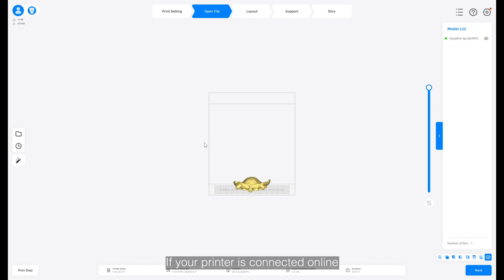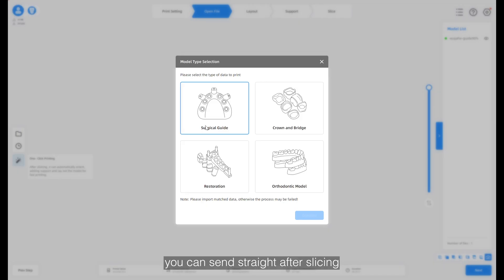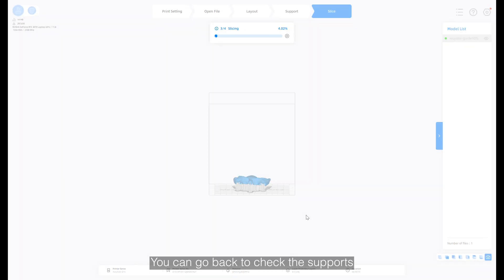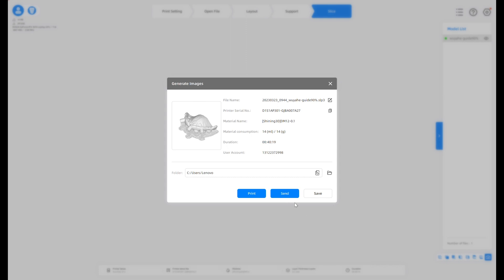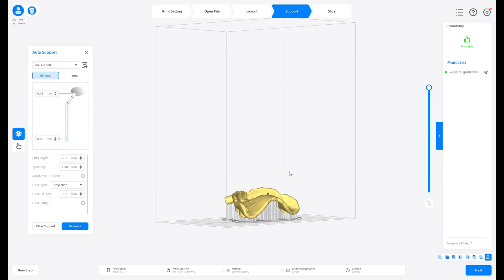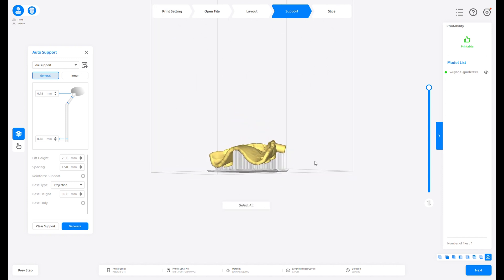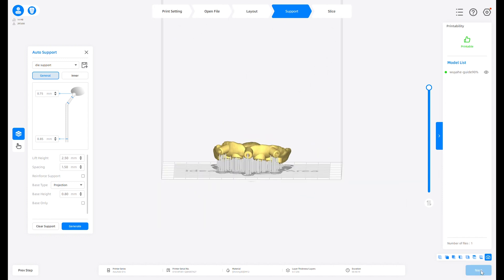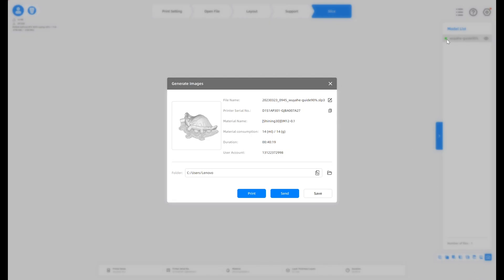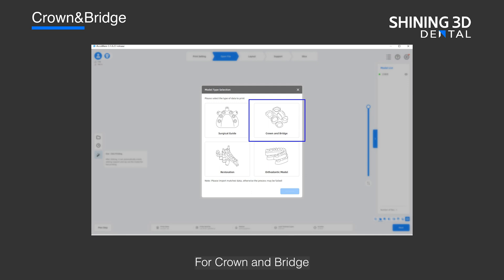If your printer is connected online you can send straight after slicing. You can go back to check the supports if you would like to add more or delete some. For crown and bridge, the workflow is the same as for surgical guide.